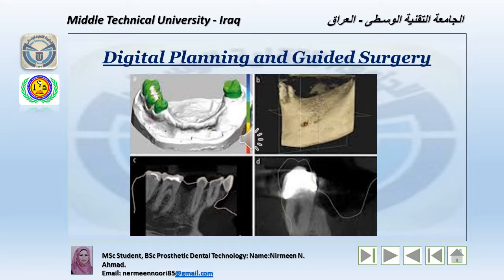It has become possible to generate prototype surgical guides with high precision. This technology is based on the real image of the bone anatomy obtained through the CT scan and the design of the computerized prototype surgical guide for implant placement based on mathematical 3D models.